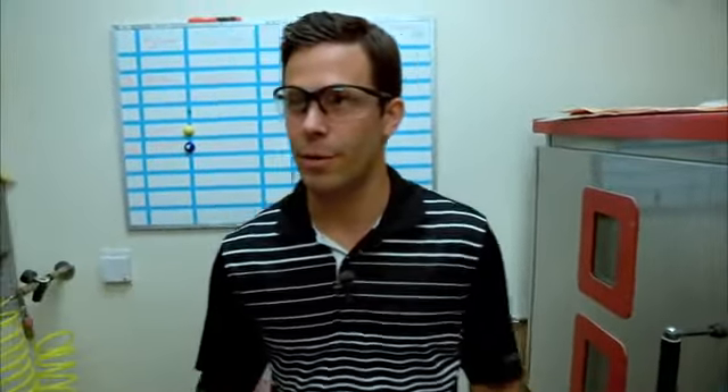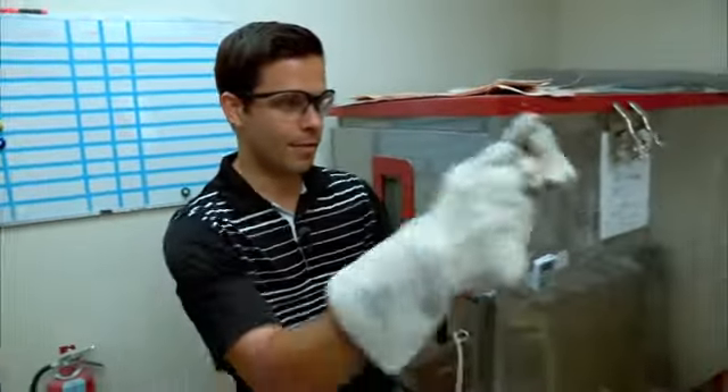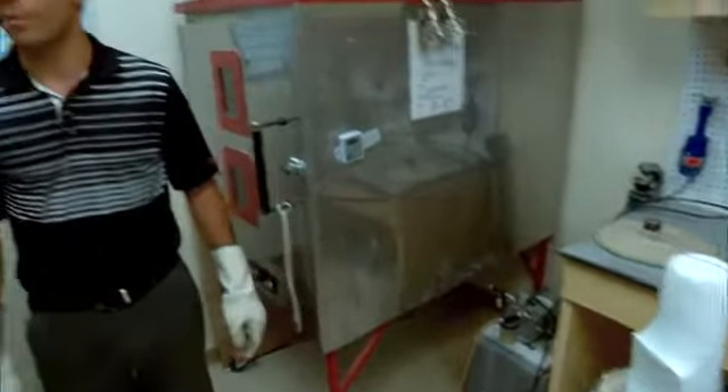I'm with Brian about to start the next step, which involves a very hot oven — but I assume we're doing more than just baking cookies. We're ready to create the check socket, which will be used as our diagnostic fitting tool. We've placed a half-inch sheet of plastic in the oven cooking for 15 minutes. At the seven-and-a-half-minute mark, we'll take it out, flip it over, and it's going to droop and form a bubble. When the plastic is fully cooked, we'll walk it over, flip it over the mold, and the vacuum will pull the plastic around the mold.